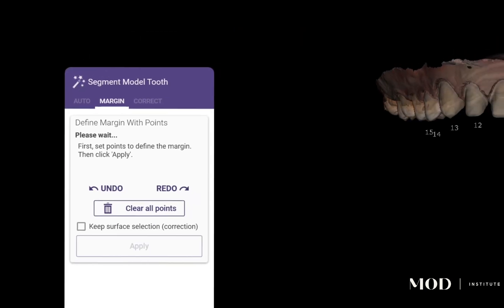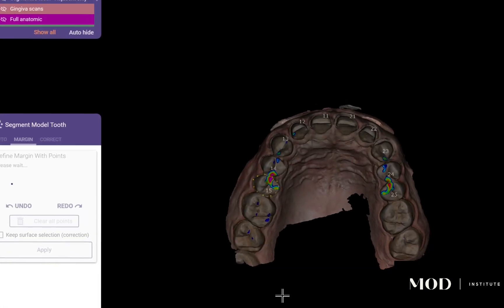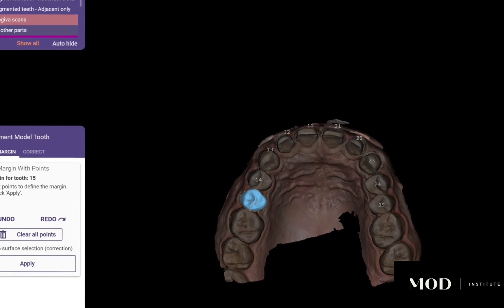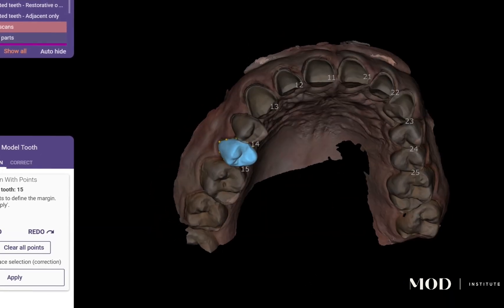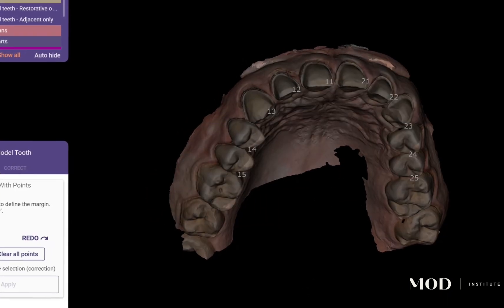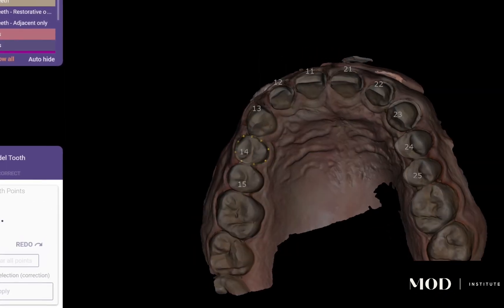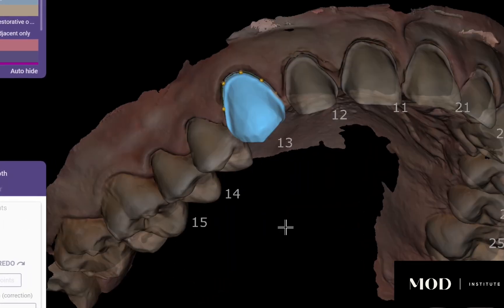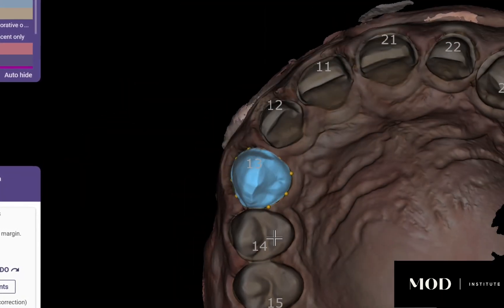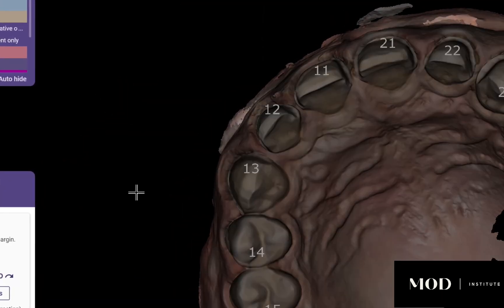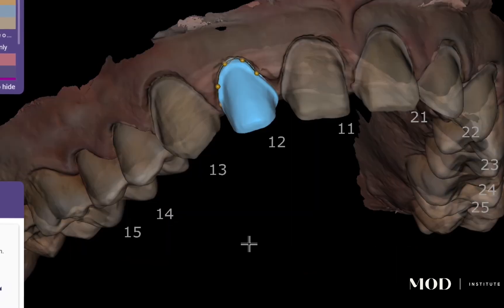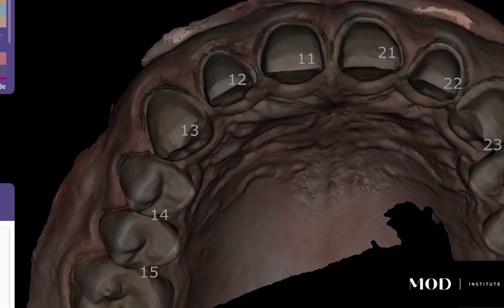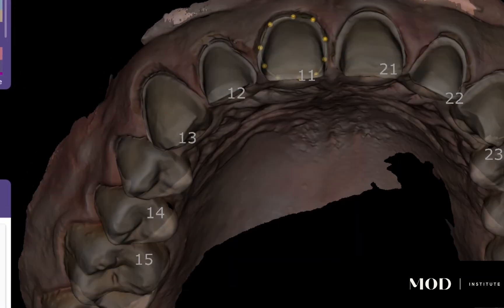On the left-hand side, select the teeth you want to be detachable dies. The software remembers the segmentation algorithm and takes you tooth by tooth so you have the opportunity to edit the segmentation line — and usually it's just spot-on perfect.